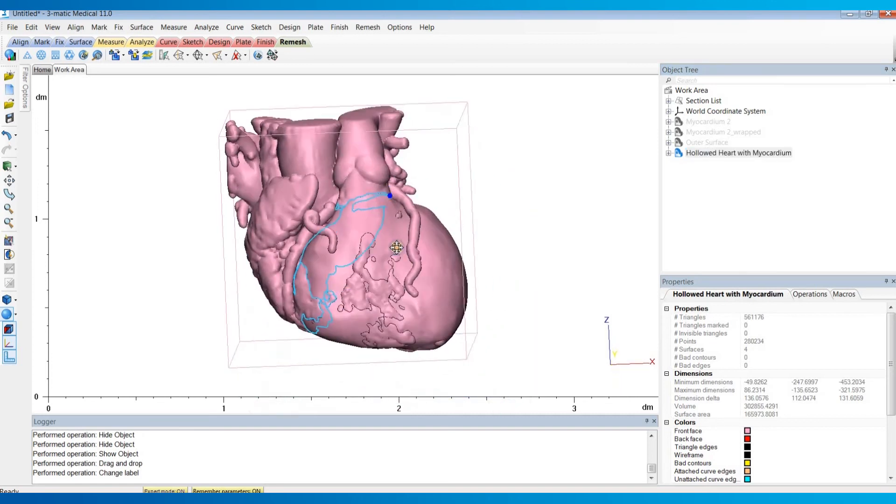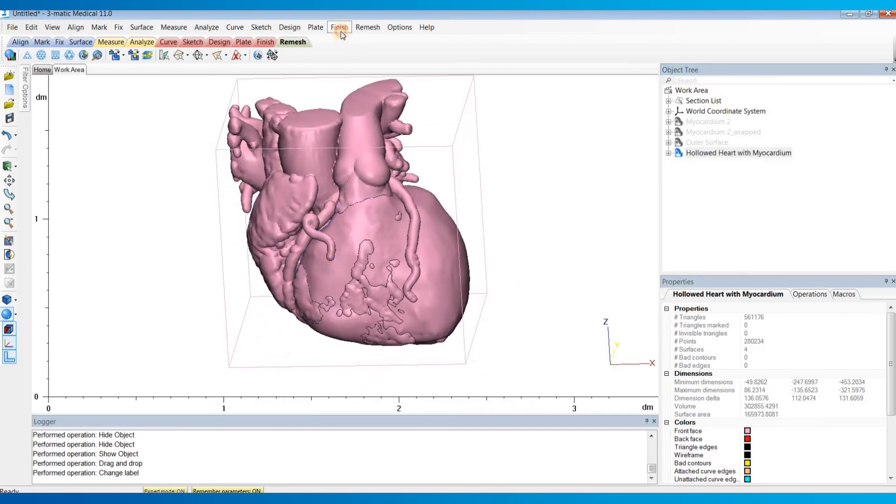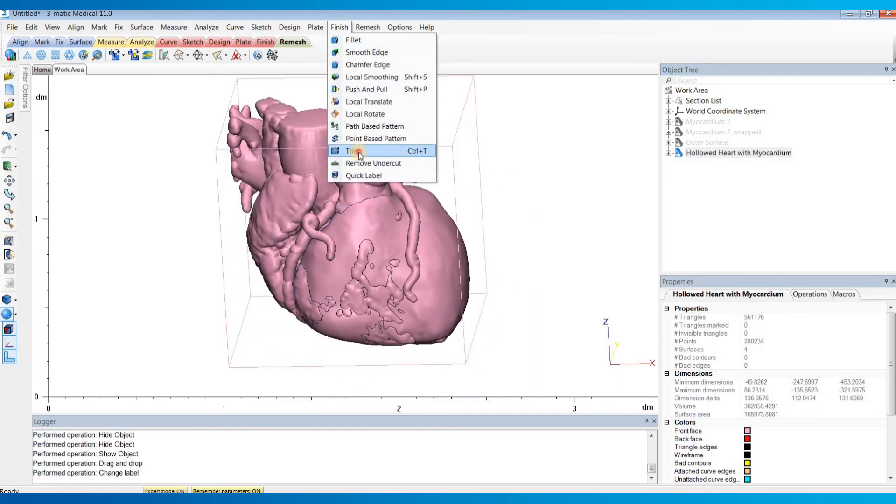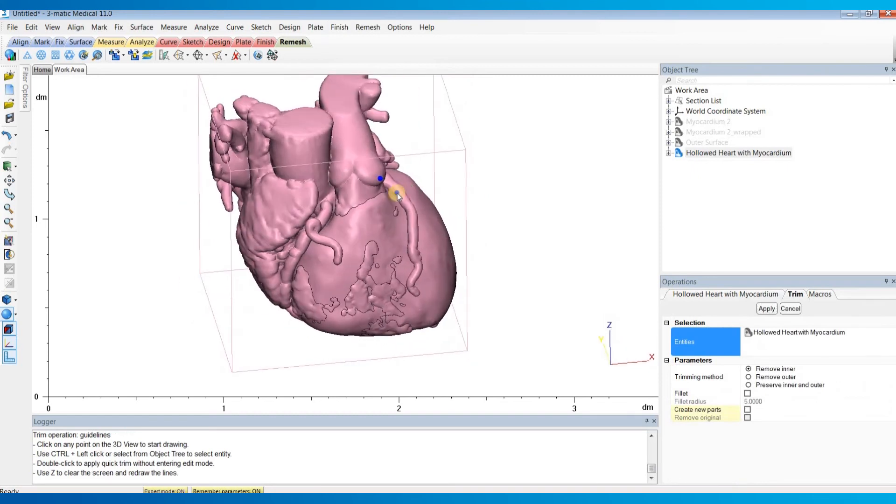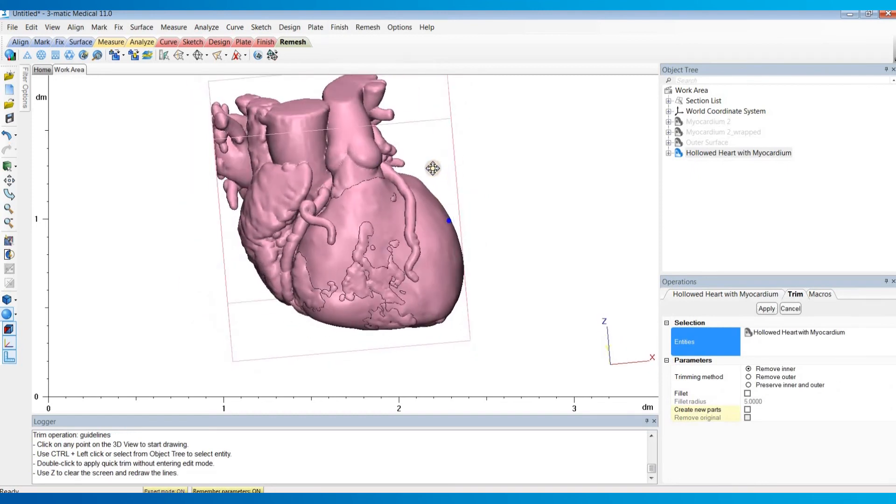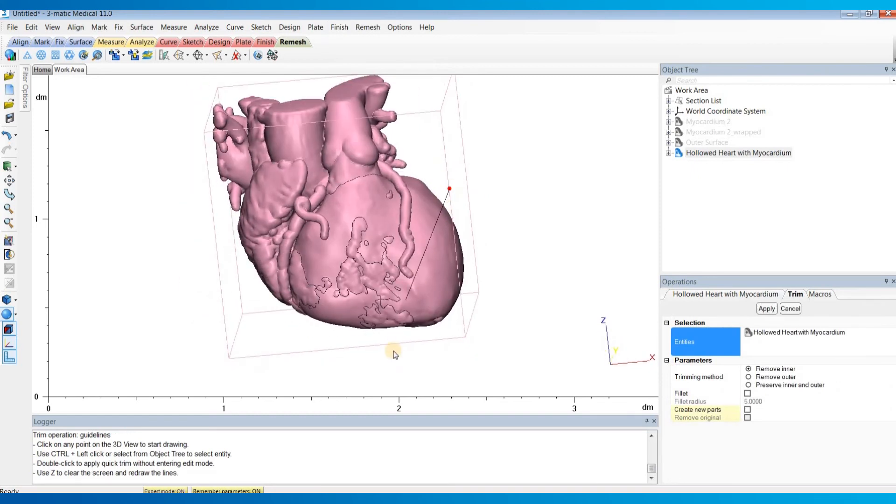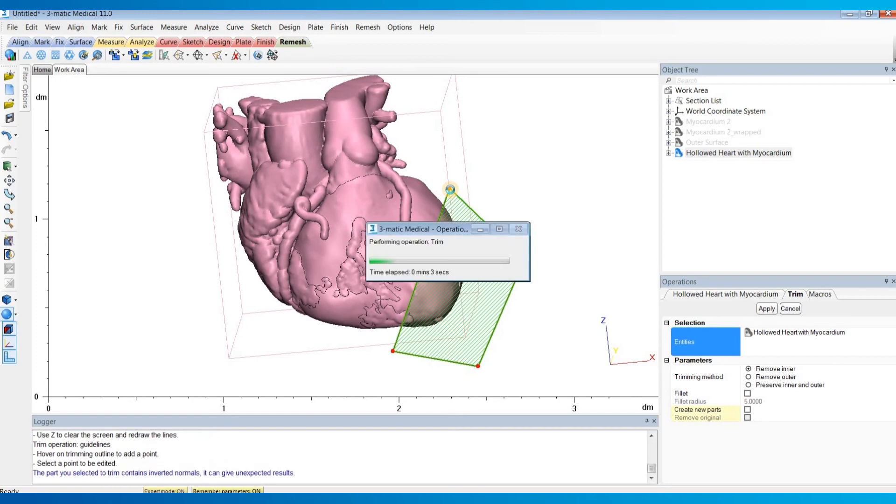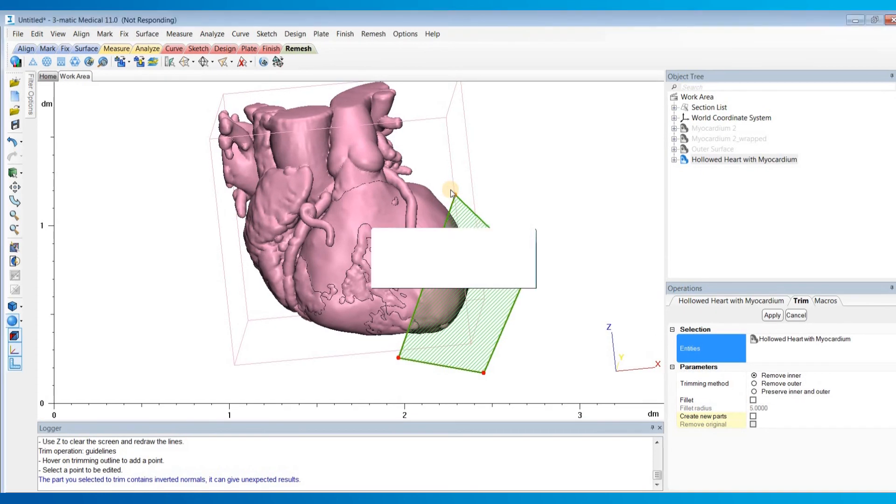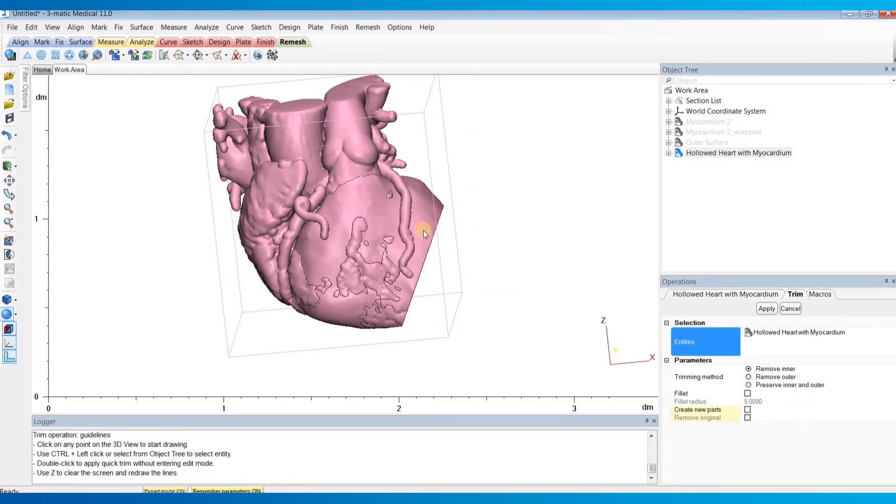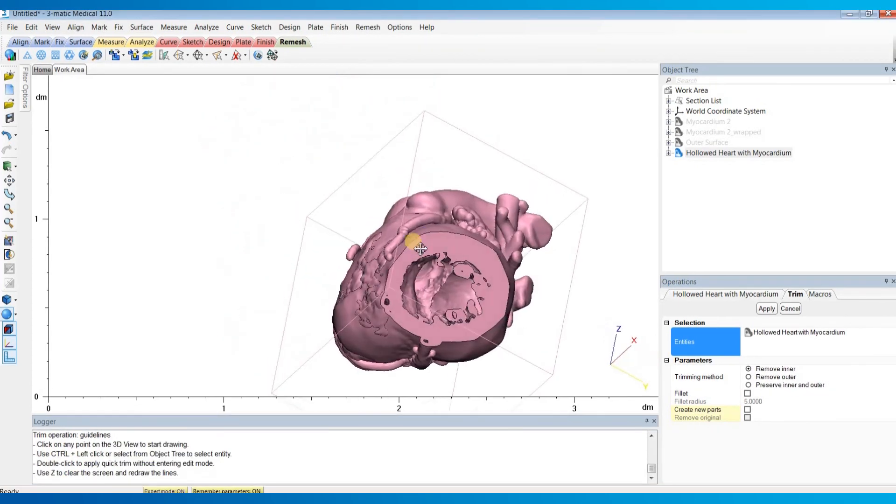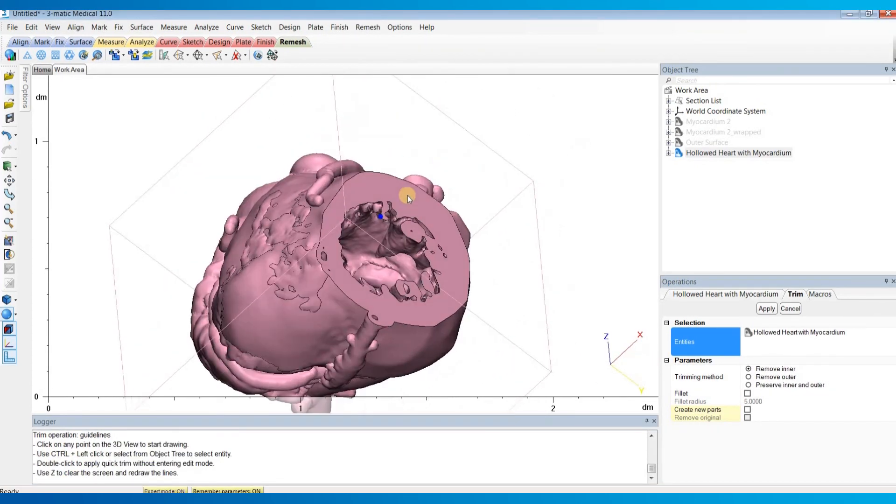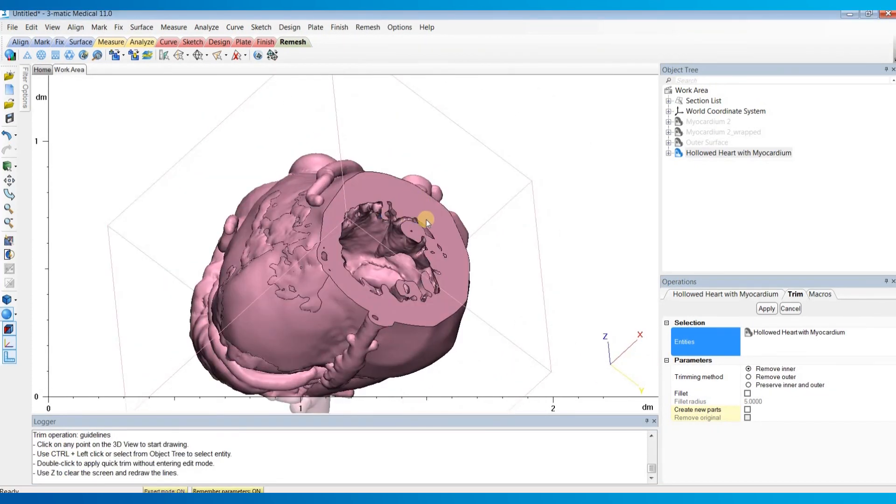If we were to cut this open, it now has the actual myocardial thickness of this patient instead of just an assumed uniform value.